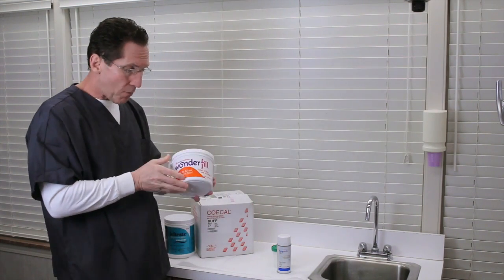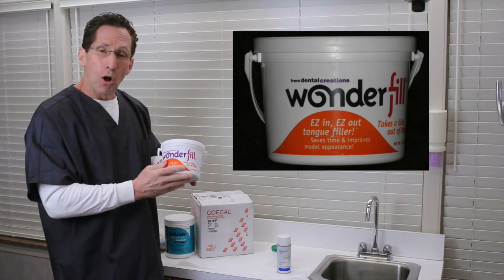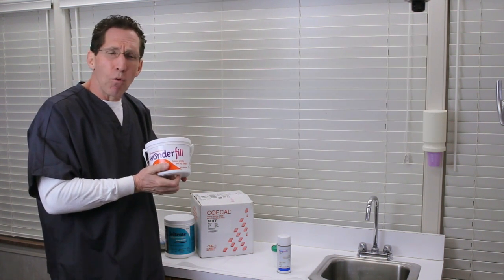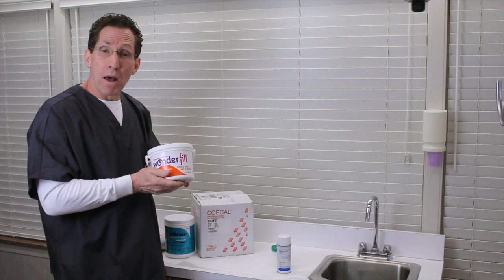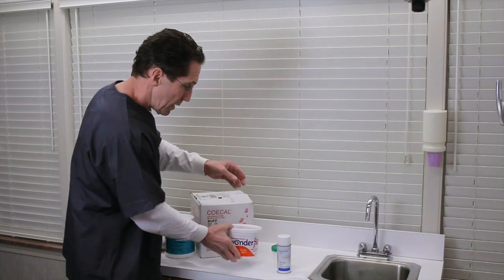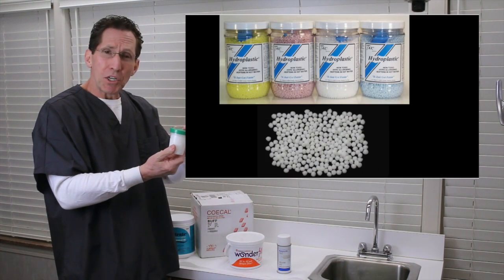Next, we have a product that was actually introduced to me by my late friend, Dr. Hegyi. And this is a material called Wonderfill, and it's a great material for filling tongue spaces. Or if you have voids in your impressions, it's a great filler material, and it works much better than, for example, some people will use Play-Doh or other kids types of dough materials. This works much better. It's very reasonably priced. Highly recommend its use.